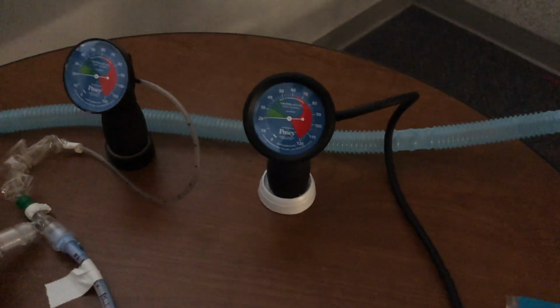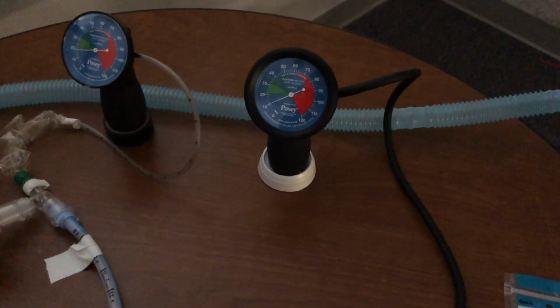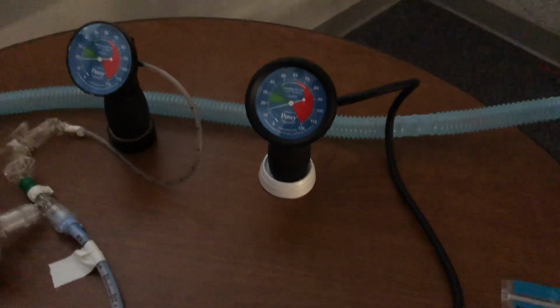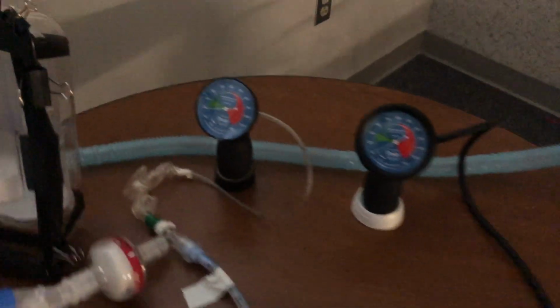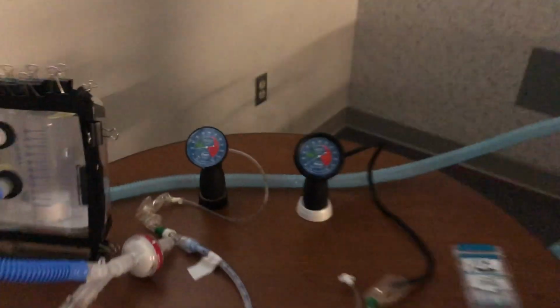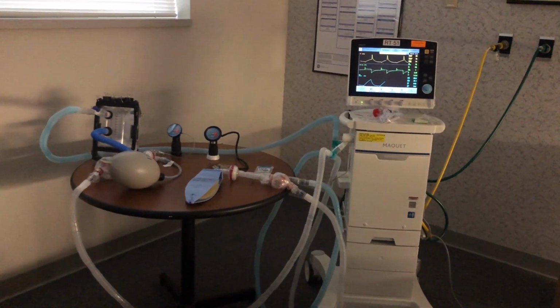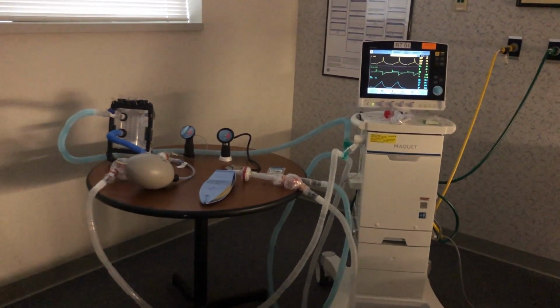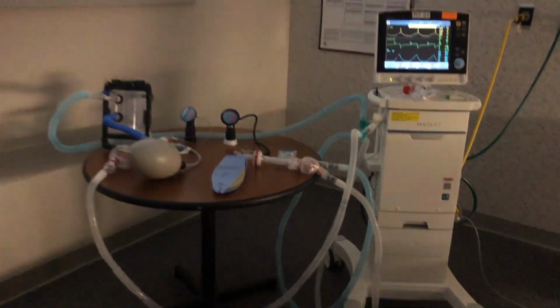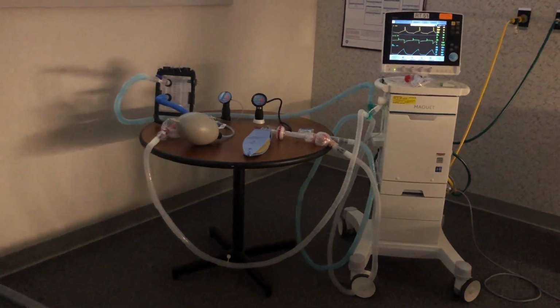Now let's, again with this patient, decrease his compliance and make him normal. Okay, and see, there is no change in the other patient. So thus we see that we can actually change the pressure and volume and PEEP, and actually measure auto PEEP without changing any other parameter. So we can extrapolate this to 3 or 4 patients.